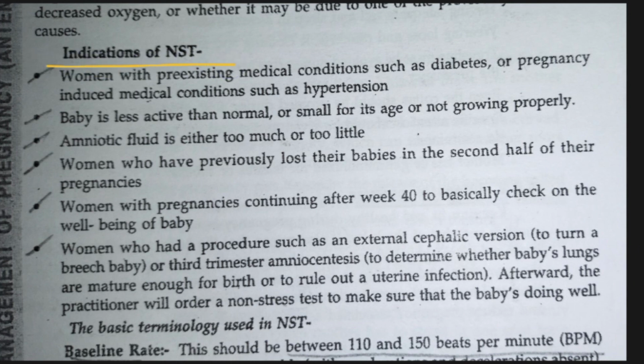Indications of NST. Which mothers are advised to undergo NST? Those are the women who have medical conditions like diabetes and hypertension or any other medical conditions. They are advised to undergo NST and to keep screening regularly. Next, if the baby is less active, if the baby is not moving regularly at intervals, or if the baby is sleeping, generally we advise them to undergo this examination.